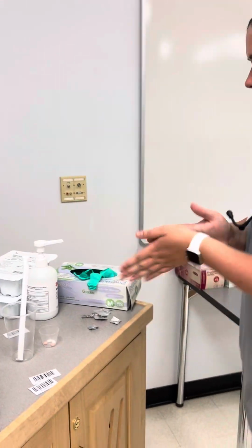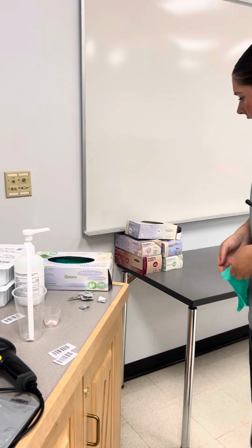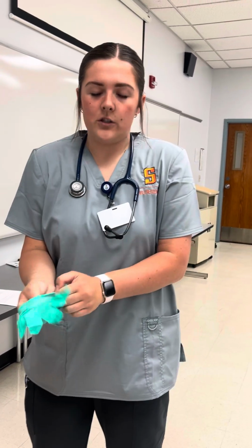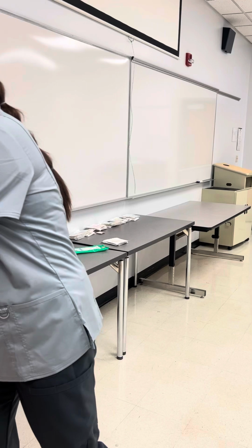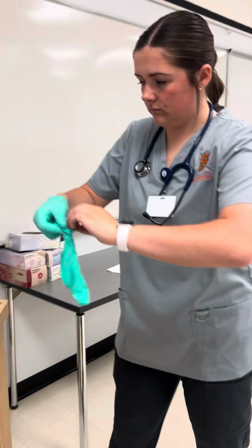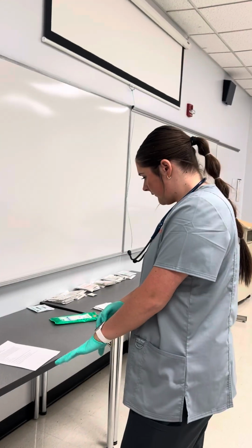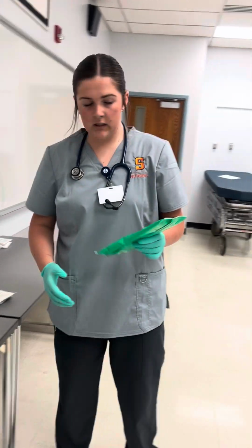Perform hand hygiene. And then put on some clean gloves because I'm going to be cleaning the area before I start my sterile technique to get my catheter ready. All right, I have my wipes.